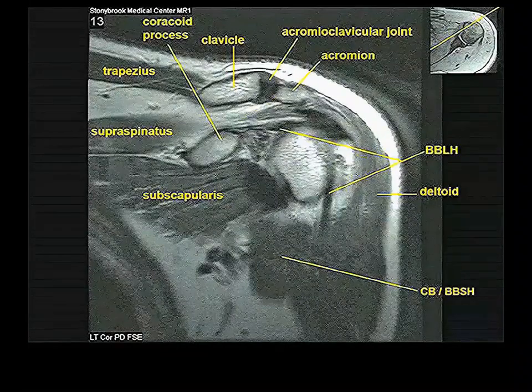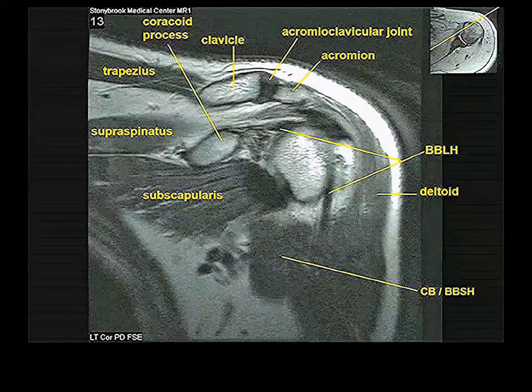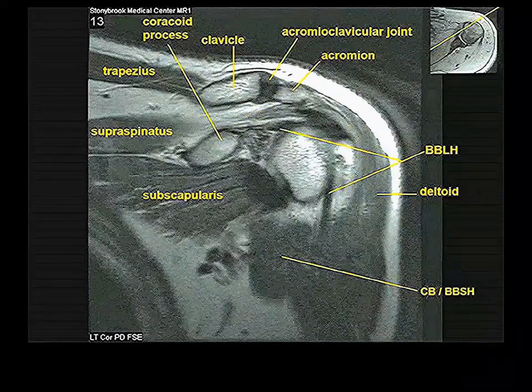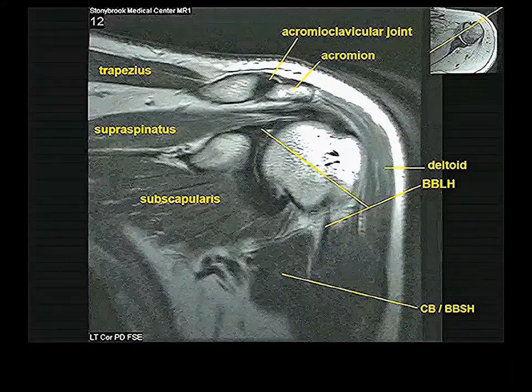We keep on going posterolaterally because we're in the scapular plane, and we see now the more proximal part of the tendon of biceps brachii, long head, and the more distal part of the tendon of origin of biceps brachii, long head. We see much of the subscapularis as it's passing inferior to the coracoid, and now we start to pick up supraspinatus as well, for the reason I told you about. We keep on going posteriorly, supraspinatus and subscapularis together.